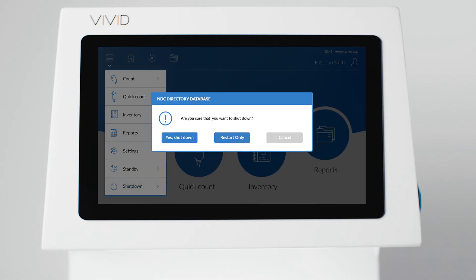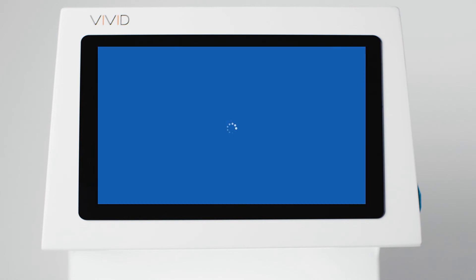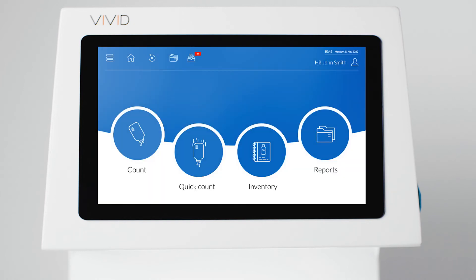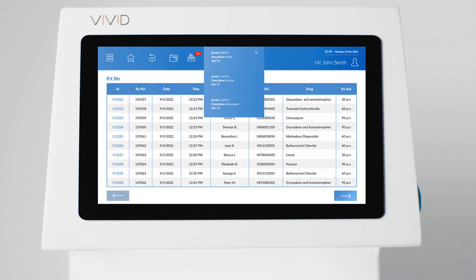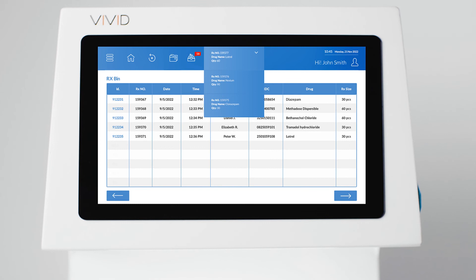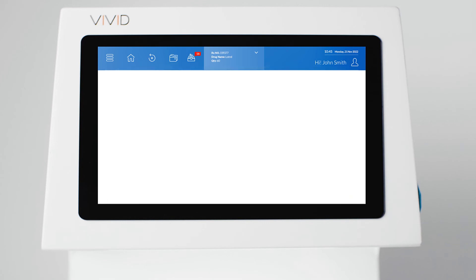After enabling the interface, restart the Vivid. Your interface is now configured and transactions received by the Vivid will begin to appear in your RxBin. The most recent transactions are also displayed in the RxBin preview.